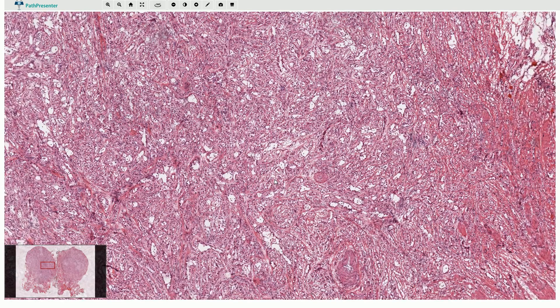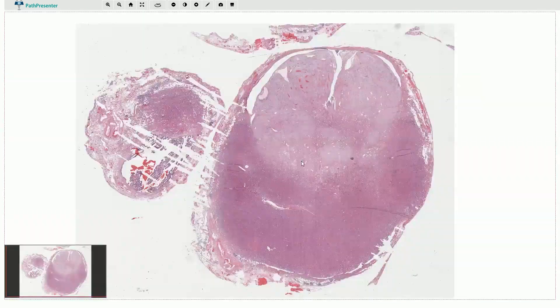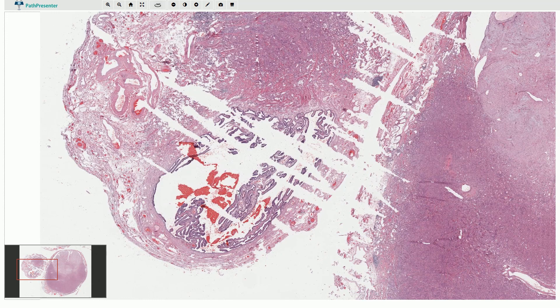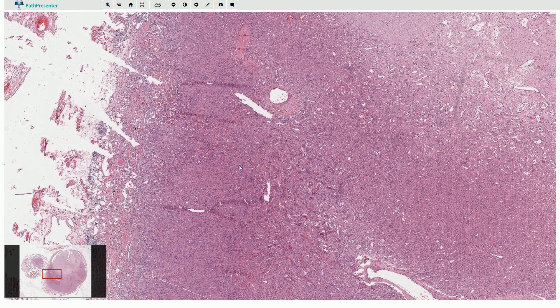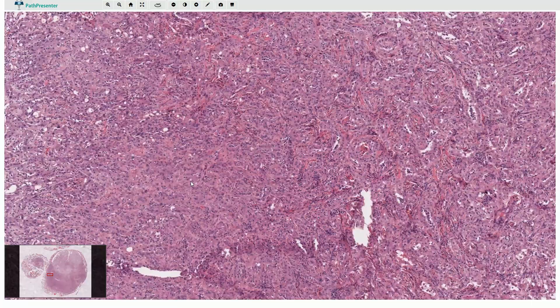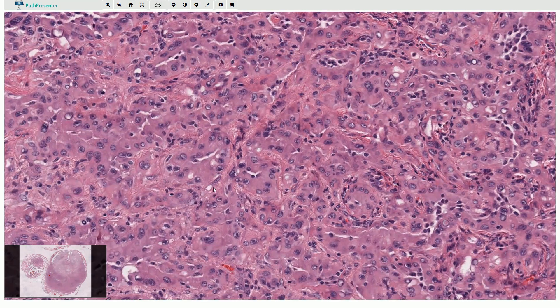Let's have a look at another example of adenomatoid tumor. This is adenomatoid tumor of the fallopian tube. The lumen of the fallopian tube is here, and this is the relatively well circumscribed but unencapsulated adenomatoid tumor. On higher magnification it looks much more solid in comparison with the previous case. This is an example of a solid pattern composed of epithelioid cells, and these epithelioid cells still create gland-like structures but the lumina are almost invisible.